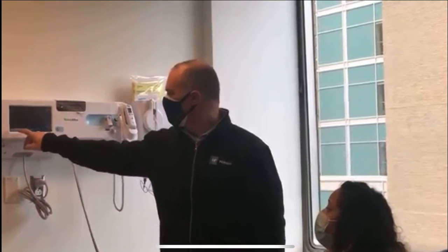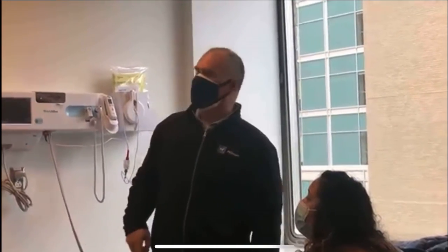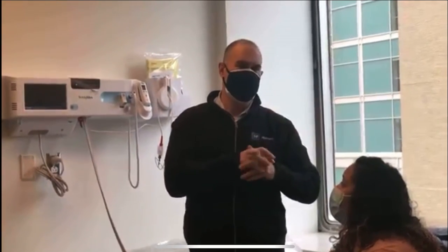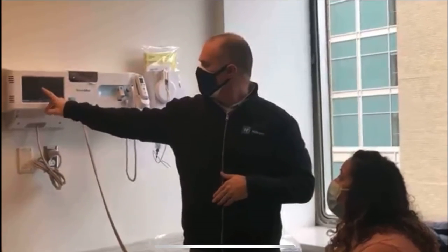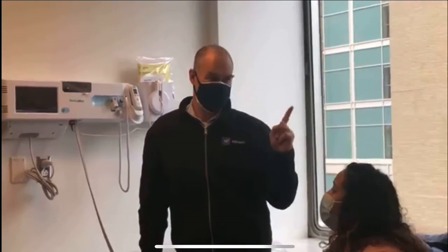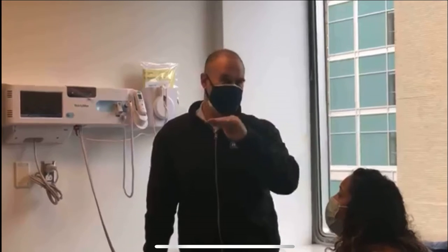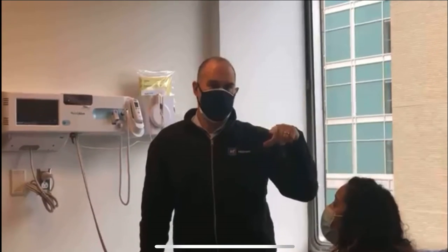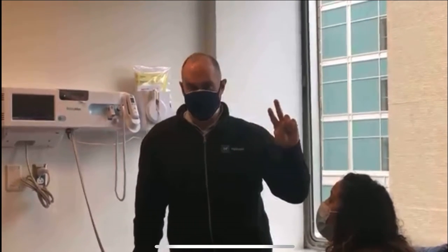If I press the clock button and then the blue button, it's going to start this sequence automatically, and you can go back to the computer and just have the patient sit there quietly. It's going to wait 30 seconds before it actually takes the first blood pressure. And the device isn't even going to count the first blood pressure — it's going to cross it out as if it never happened.